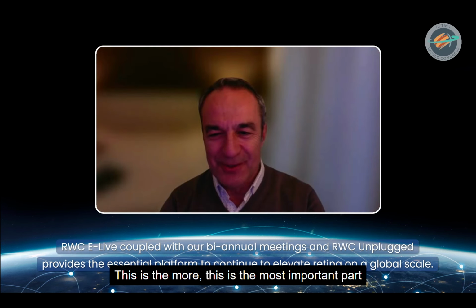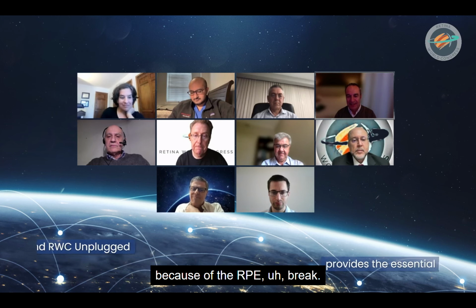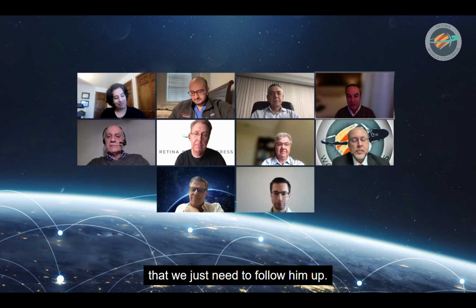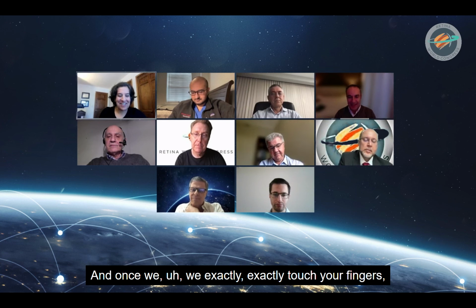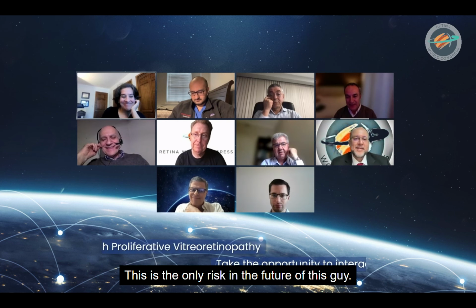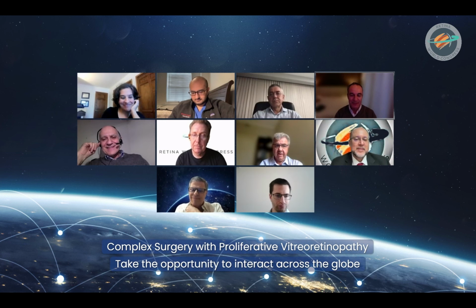Congratulations on your question. This is the most important part of this surgery now: the CNV creation in the future because of the RPE break. You are absolutely right. I don't think there is something that we can do to prevent that. We just need to follow him up, and once we see it, we start to inject anti-VEGF. This is the only risk in the future of this eye.